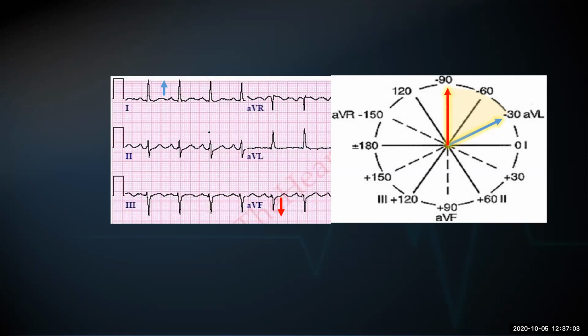If you want to be absolutely particular, you could see, well, so let's see, lead 2, it's somewhat isoelectric. So that would put us right at 45 degrees, or actually right around 30, I should say, because of 60. So you could use maybe even lead 3 to help you, and lead 3 is negative. So then it would put it more towards -45 or so. So that would have confirmed our suspicion that this is a left axis deviation. So again, -30 to -90 is the definition for left axis deviation.